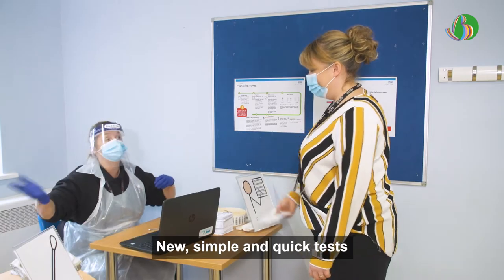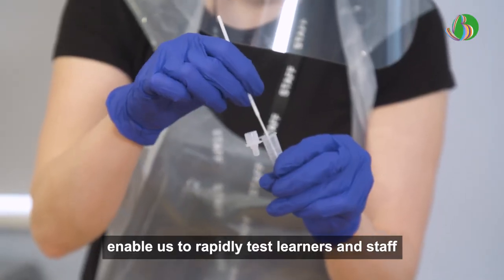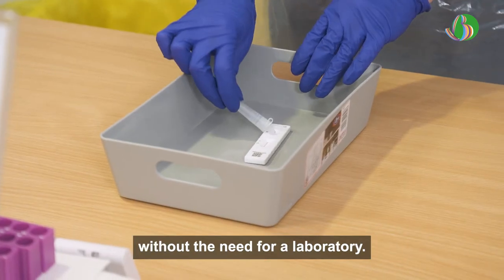New simple and quick tests, known as lateral flow device tests, enable us to rapidly test learners and staff without the need for a laboratory.